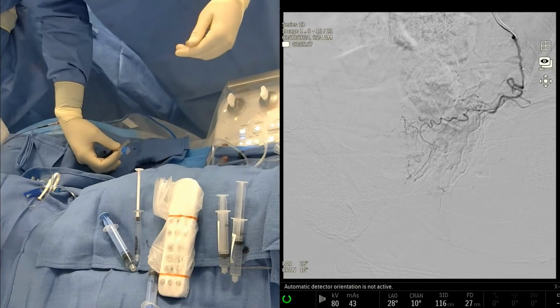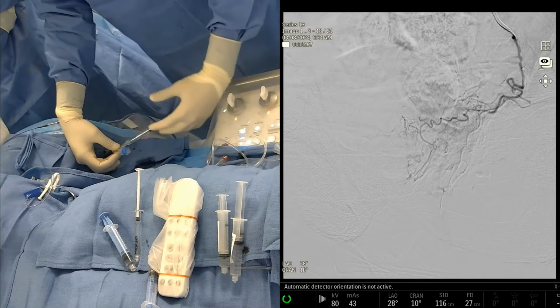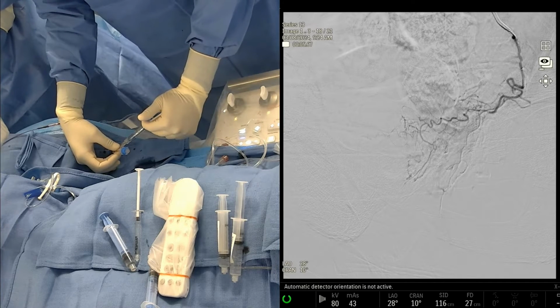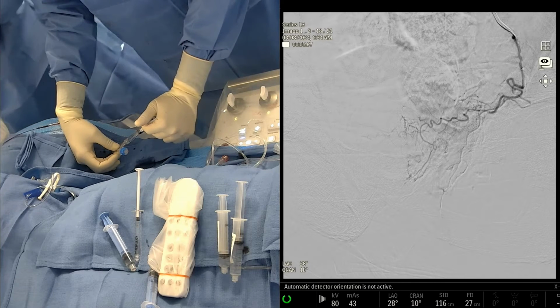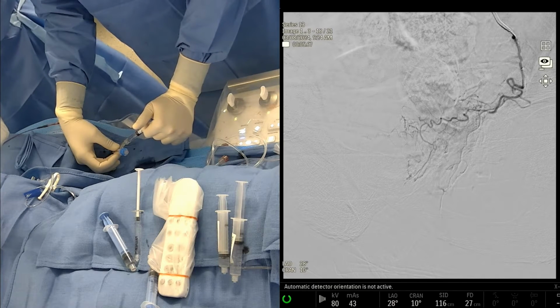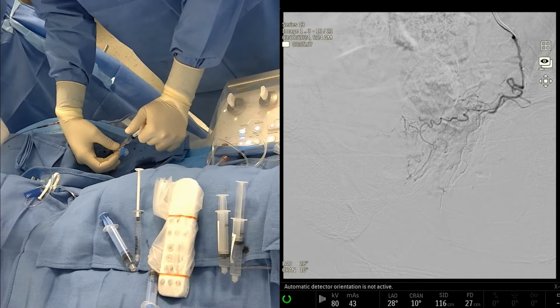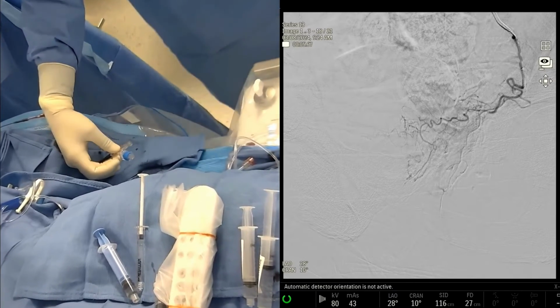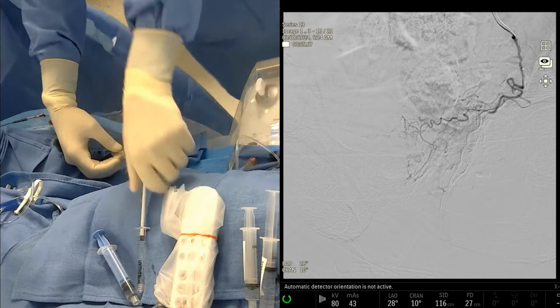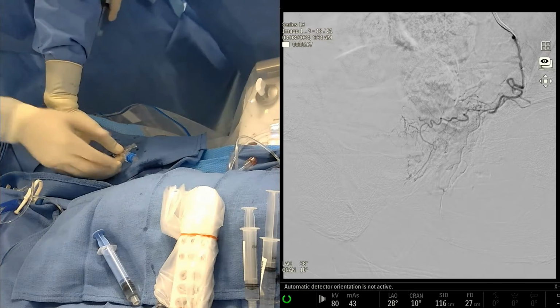Yes, but I agree with you, Viv. We should go distal. You can see that prostate artery pretty well here, and you can see the middle lobe pretty well too. If you look closely at this angio, you'll see these little spidery branches that are going north. That's the median lobe vascular supply. And so we really want to try to get embolic into that spot, but we'll see. Okay. I think you're seeing nice periurethral supply too, and even some cross filling to the other side.